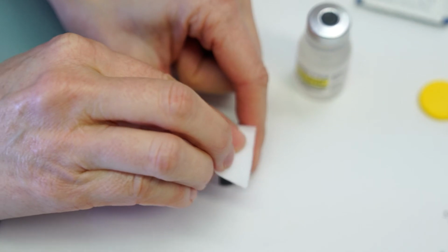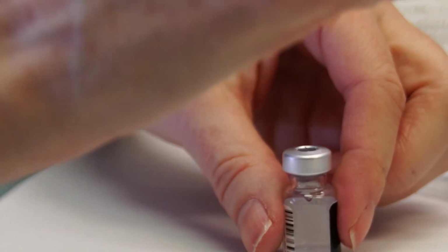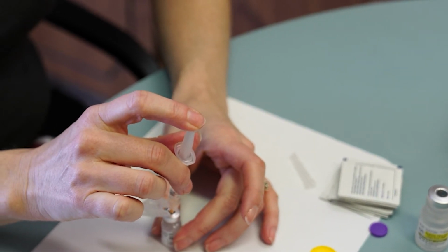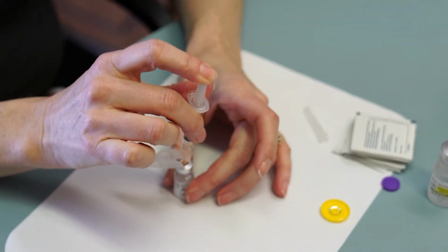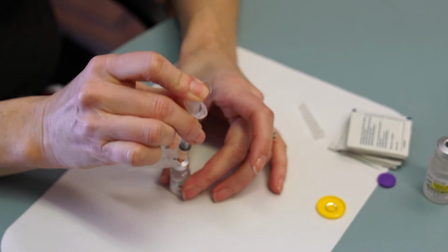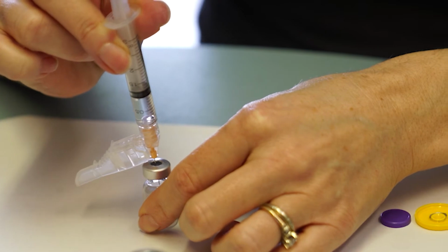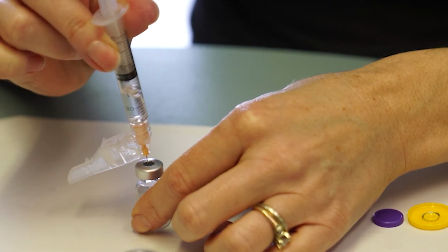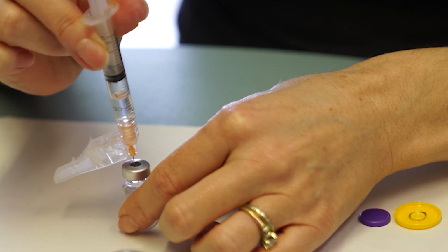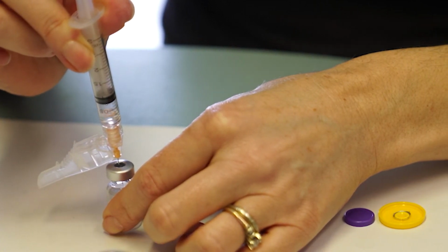Clean the top of the Pfizer-BioNTech vaccine vial with alcohol and allow to dry. Pierce the rubber stopper to add the diluent to the vaccine. This must be done very slowly to avoid bubbles. About half of the diluent should be slowly depressed from the 3 mL syringe into the vial along the side of the glass. There is a lot of pressure and you will feel this in your fingertips. Allow that pressurized air to flow back into the syringe. Keep the vial lower than the syringe so gravity will keep the fluid closer to the needle tip. Gently add the rest of the diluent very slowly, being careful not to get any bubbling.